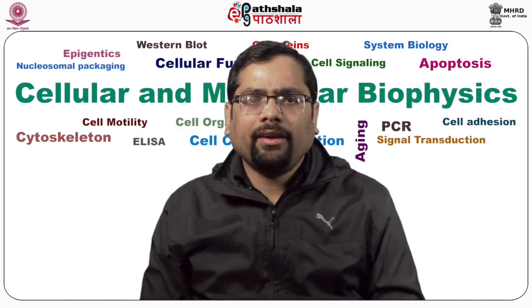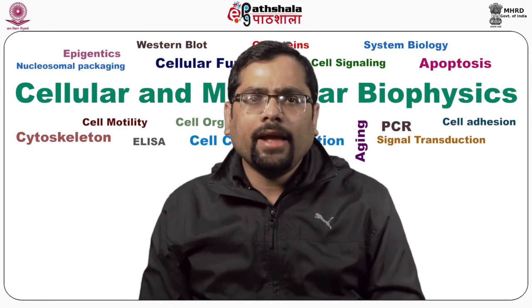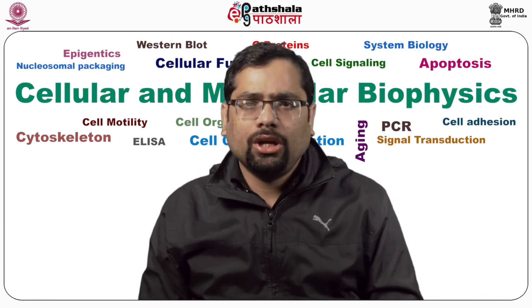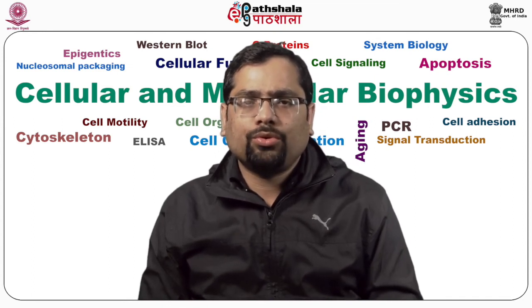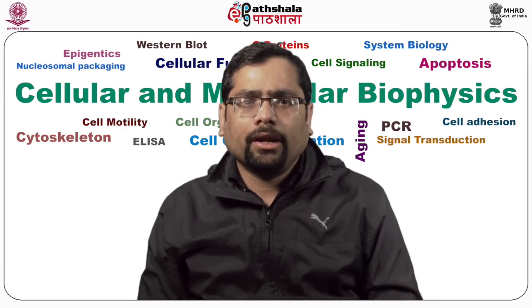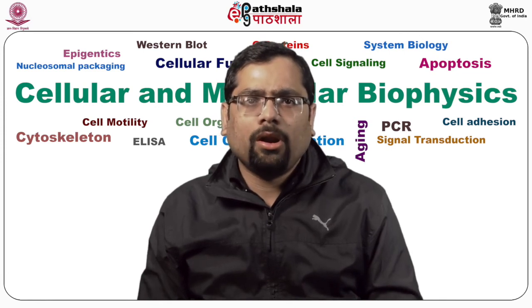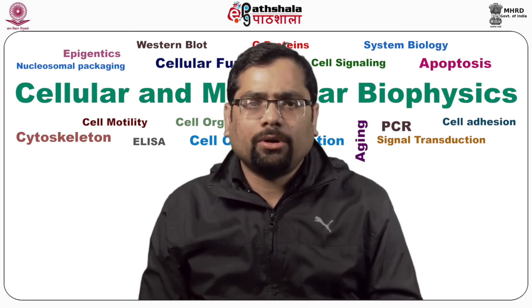Continuing with the principle of FNIRS, the increased oxygen transport to the area, due to the neurovascular coupling, typically exceeds the local neuronal rate of oxygen utilization. So, whatever oxygen is being utilized at the tissue, there is more oxygen transported to the particular tissue due to that neurovascular coupling. It results in an overabundance of the cerebral blood oxygenation in the active area. So, we will find more oxygen in that particular area.